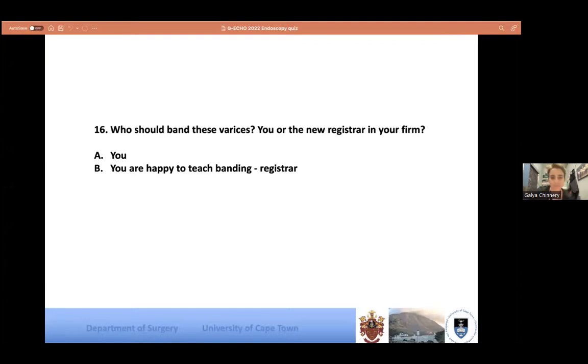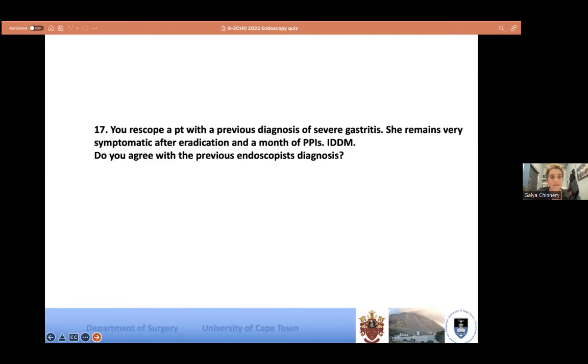Okay, let's see. Okay, you're going to do it. Good. The only person who's going to let someone do it is Prof. Thompson. I would say you should do this one, in that, I hope you noticed, at 3-4 o'clock distally, there was some slough. This is definitely a varix that has recently bled, and you do not want a slightly more inexperienced person applying some suction to that and then letting go by accident. That's going to be an absolute bloodbath. So this is a varix somebody with previous experience should do. I agree. I would do this one myself too.